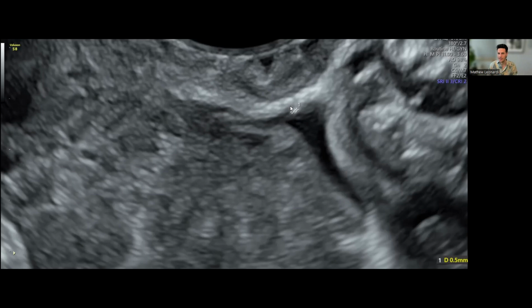This is tiny. And so I turn the screen to the patient and I say, look, this is what is in your pelvis. This might be one deposit of several superficial areas. I can't always see all of them. And at this point in time, I still can't rule out superficial endometriosis when I don't see it. But I do like to show people what is possible. And 0.5 millimeters is pretty impressive that we can see this.